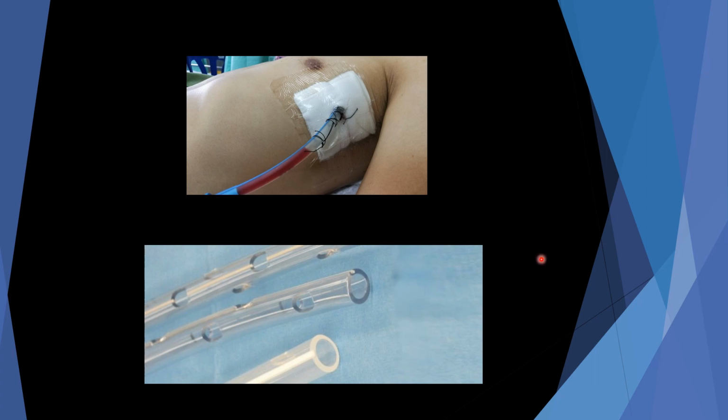So when you have a patient with chest tubes, they're inserted quite a few inches up into that chest. Every time they breathe, cough, or move, these tubes are going to rub and they're going to have discomfort. So always keep that in mind, and that's why I wanted to show you this. The small ones that we see are usually more rounded, more comfortable, more pliable. These are not that pliable.